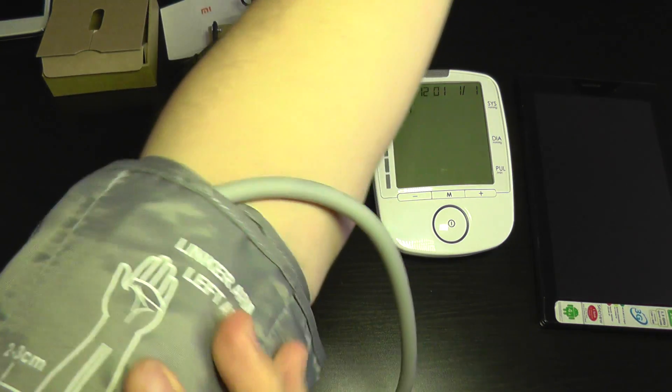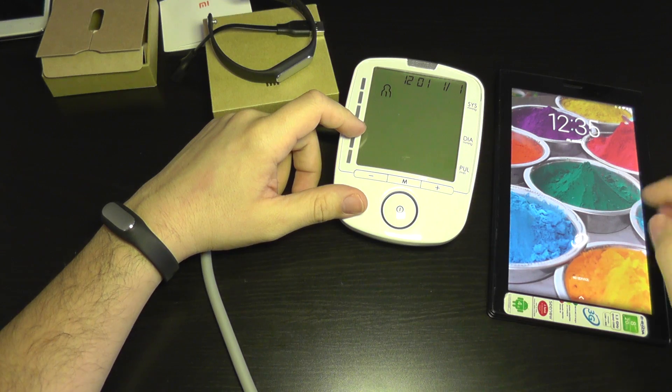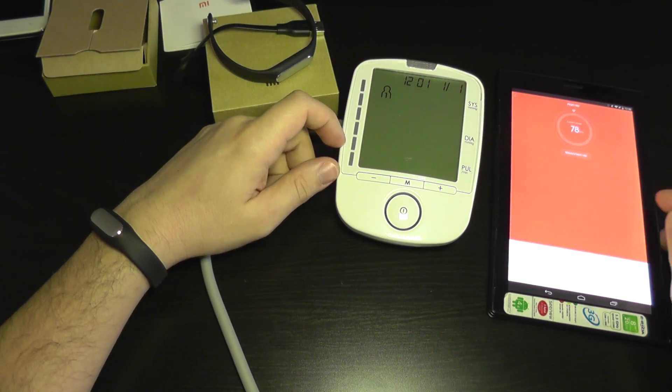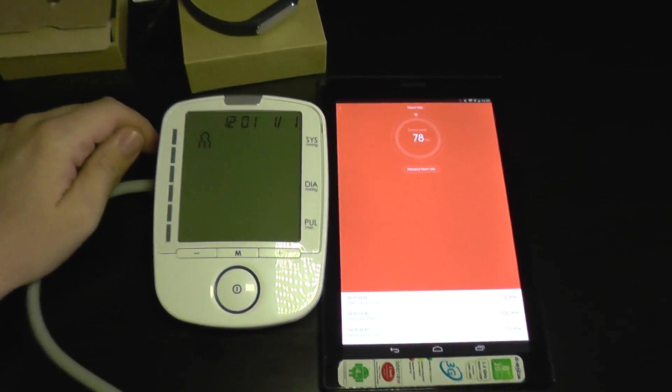The arm cuff is installed here. I'm going to also turn on the tablet. I also have a Mi Band here, already configured with my profile. I'm going to put this one next to the other.